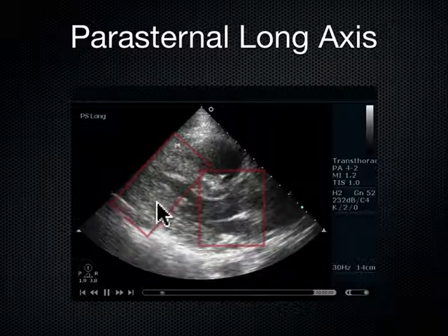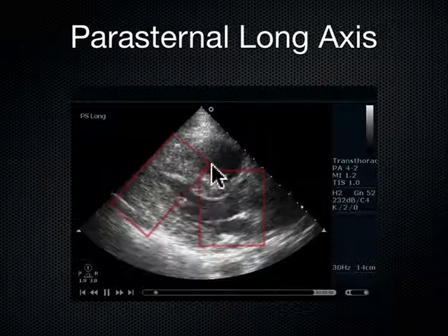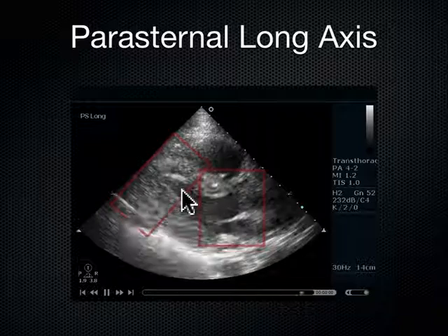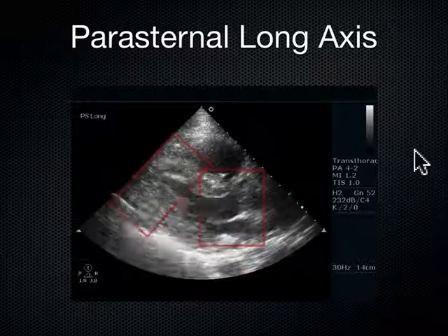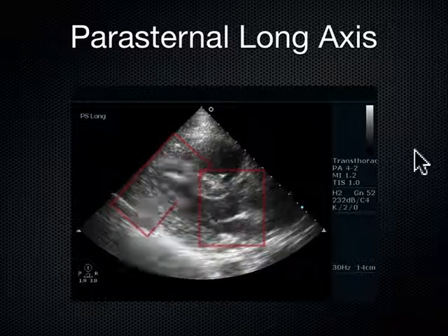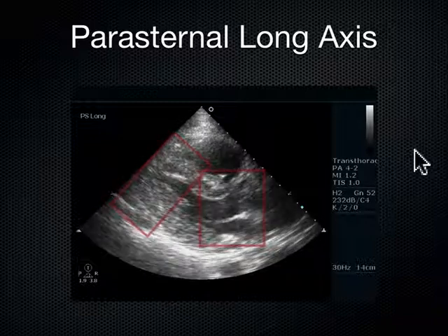We see that posterior wall, not really squeezing together very much. In fact, not really moving at all. Here's another thing I'm noticing. The right ventricle is up here. It's actually larger than the left ventricle, and in certain settings, this is a problem, because when we see somebody with a large right ventricle, normally the right ventricle is only 2/3 the size of the left ventricle.